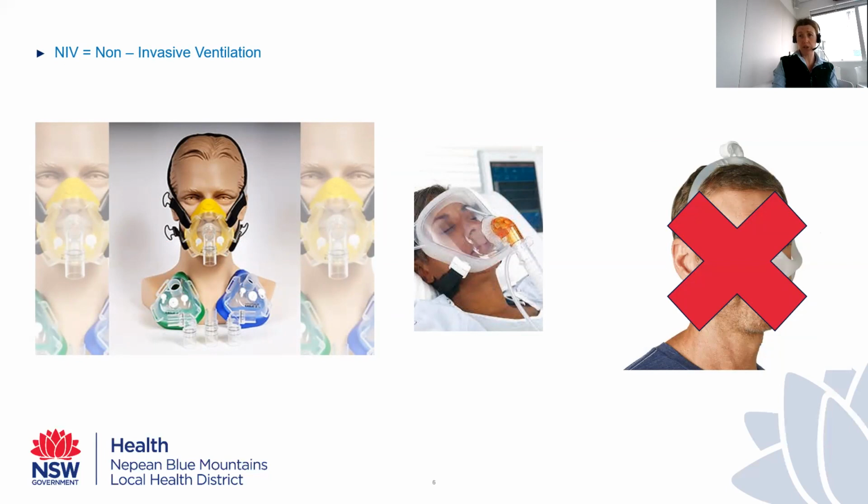That's what we're setting on the non-invasive machine. And when you just have a mask on the patient's nose, every time they open their mouth, all of the gas flow that we're giving just comes out the mouth because it's the path of least resistance, and you actually lose the pressure in the airways that we're trying to deliver. So yes, suitable for chronic conditions, not usually suitable for acute conditions.